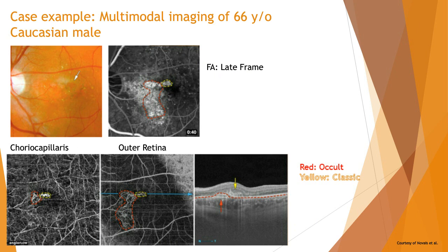A mixed CNV case: the patient has both occult and classic characteristics. The fundus image gives little information about CNV differentiation. The B-scan shows two distinct lesions — the RPE is delineated with a dashed red line; the yellow arrow points to the area above the RPE (classic part) and the red arrow to the area below (occult part). On fluorescein, the occult part is very diffuse and poorly delineated. OCTA beautifully captures the fine neovascular frond in the outer retinal slab — extremely useful for retina specialists to assess pre- and post-treatment borders.